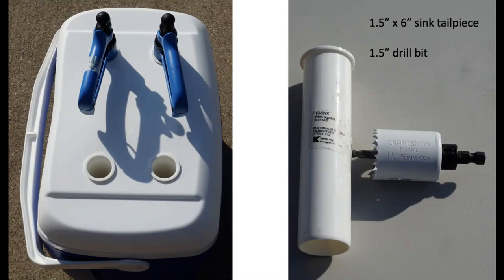Then what we do is take a little stool and set that ice chest on it. That's just so whoever is vaccinating doesn't have to bend over quite as far when they get ready to drop that syringe in the holder between animals. I will tell you, in this situation, when I'm dropping straight down like that, I personally do not recap my needles between each animal. But that's assuming you're not going to be hitting that ice chest or the side of the holder and you can drop it straight down. If you do have a tendency to hit something, then I would recap that needle between each animal. If you don't, it's a little easier to drop it down. You can reach in there, grab it, reach over, give the vaccine, drop it down. It just simplifies things and takes one step out of the equation.